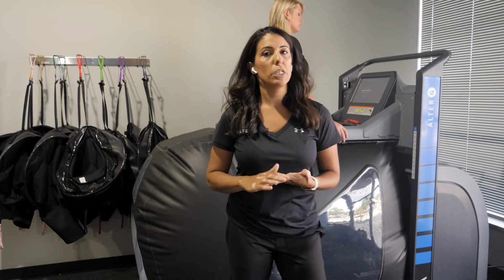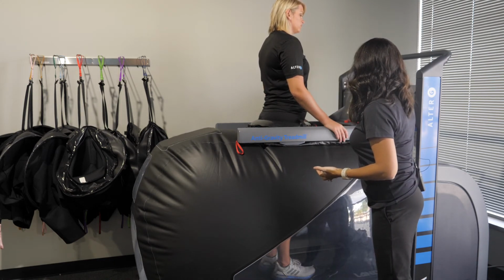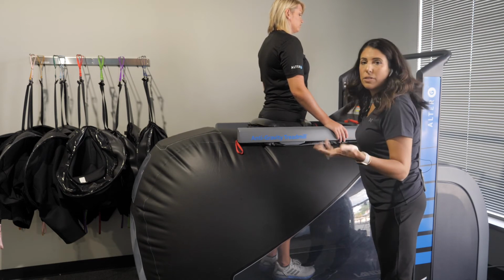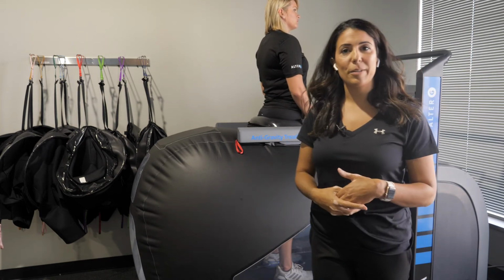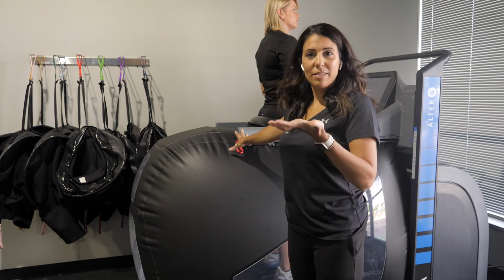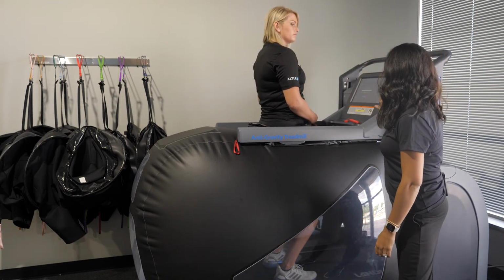This is great for a few reasons. Your patient can now take a break, so I can bump up the body weight support. So I can take her down to 70, 60% body weight or more, and just let her sit in the shorts a little bit. Remember, it's a fall-safe environment, so not only will the shorts help her to be able to sit into the bag, but the body weight support will too. So you can go ahead and just sit in a little bit.